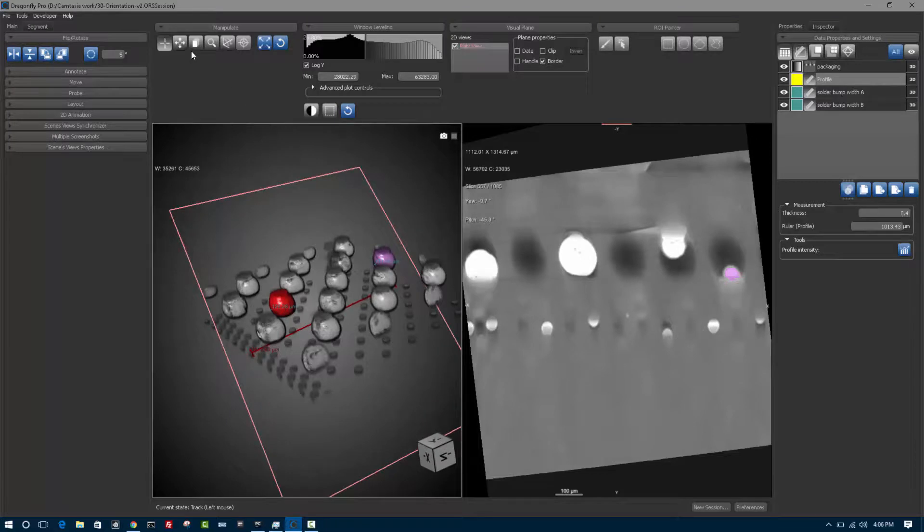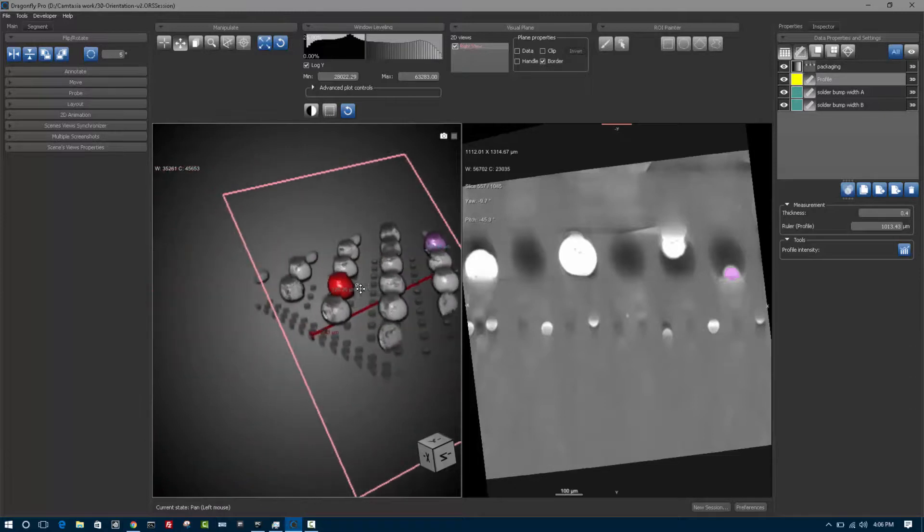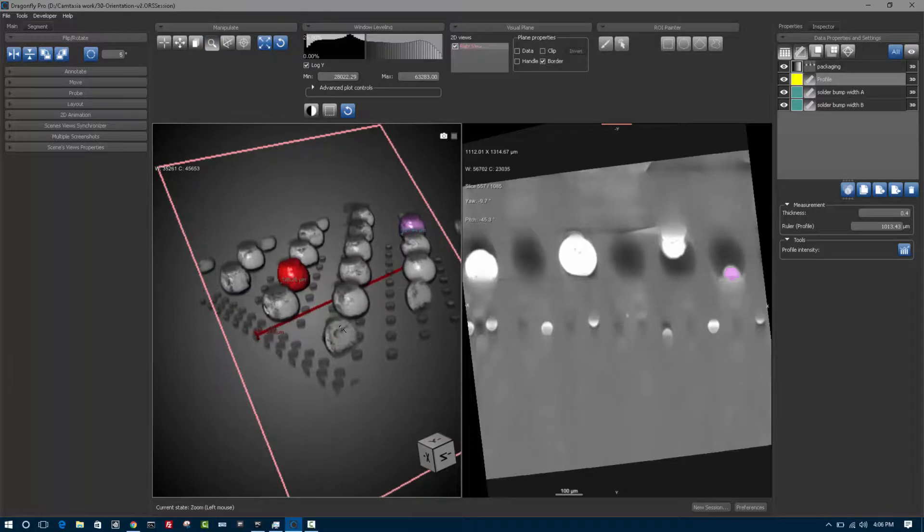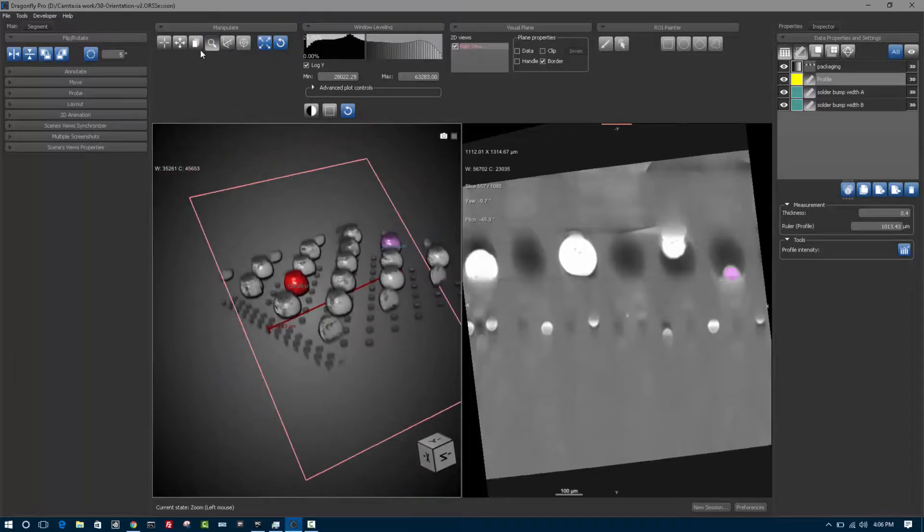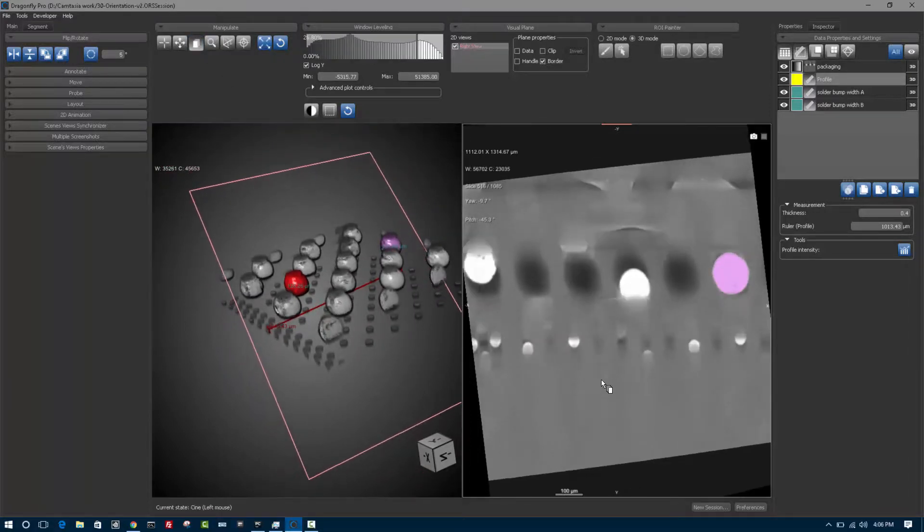The different gray buttons you see on the user interface are other state buttons. So if I click on this button, I'll now be in the pan state as indicated in the status bar indicator below. So you can pan around to look. Likewise, there's a zoom state. There's something called the cine state, which lets you scroll through slices. So the gray buttons are state buttons.